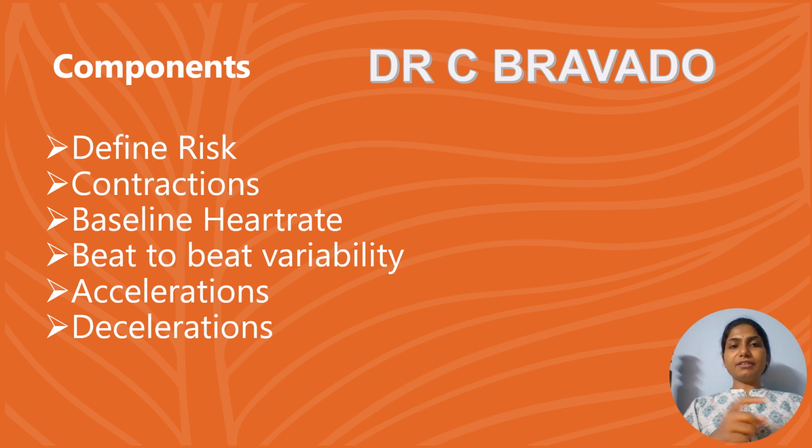That is why the fetal heart rate will range between 110 to 160. Because of this constant interaction, there is one set point where there is a basal heart rate. So it is between 110 to 160. Anything below 110 is called fetal bradycardia. Anything more than 160 is called fetal tachycardia.